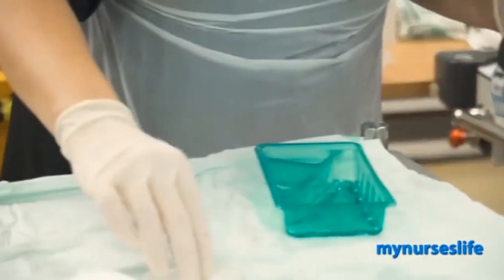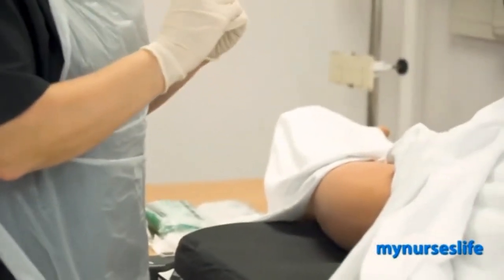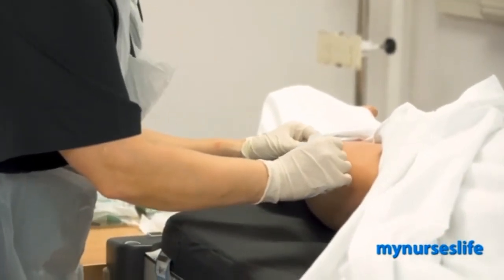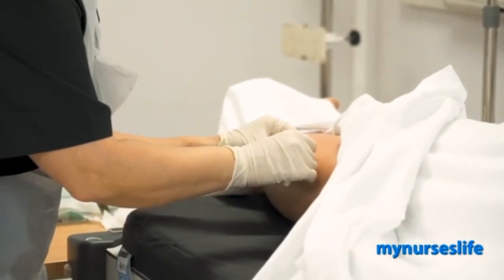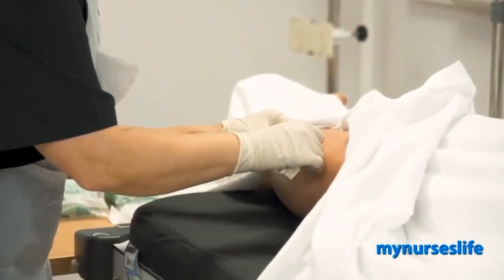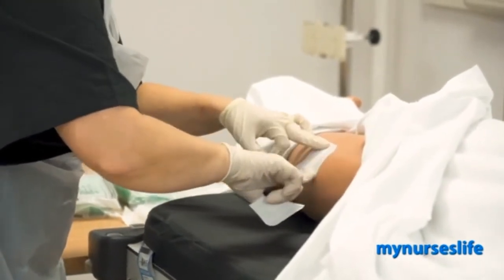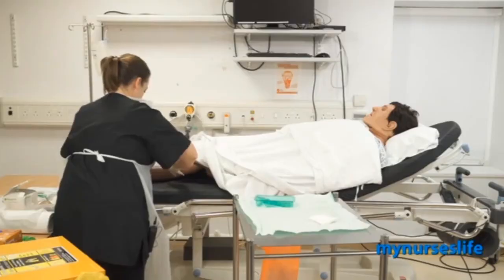And I'm now going to put the dressing on. So you can use both hands for this part. Just going to place the dressing on. That's on nice and secure.